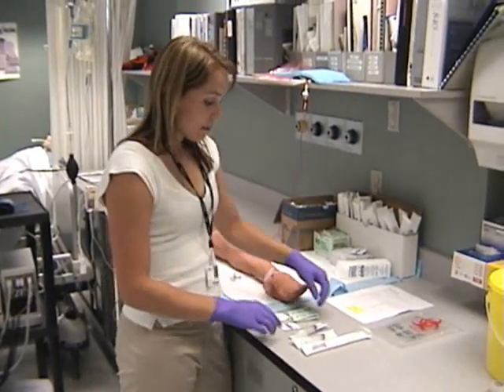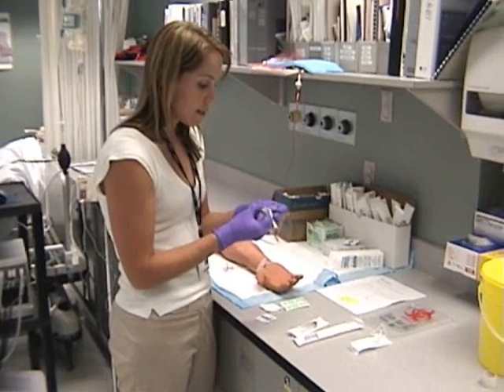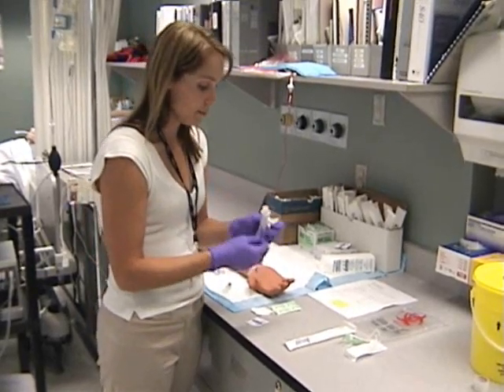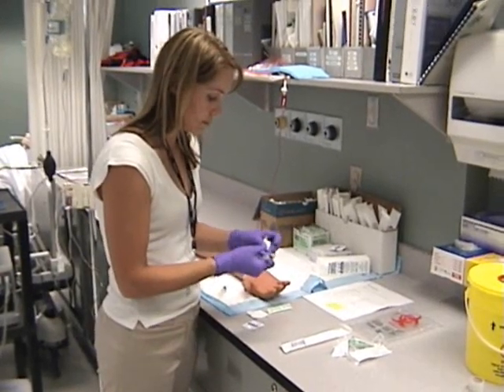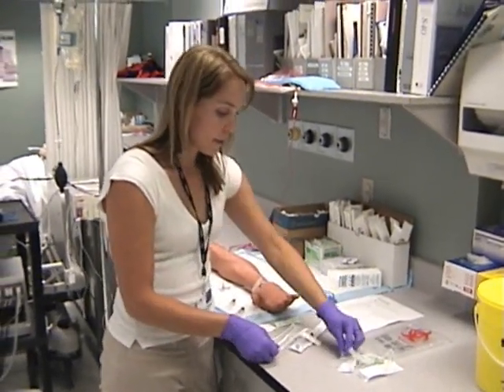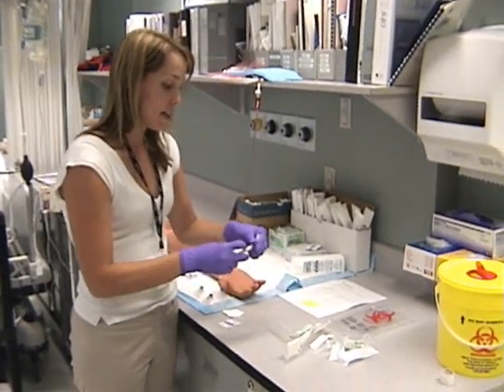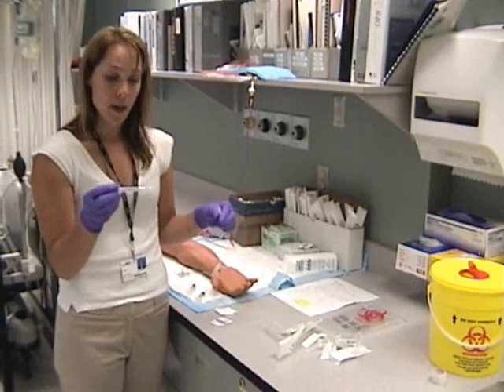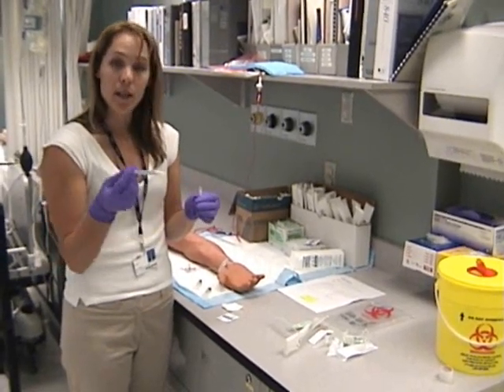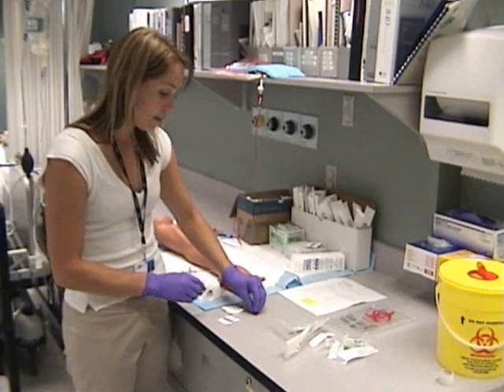To do the procedure, set up your equipment. For each of the syringes, open and put on the blunt plastic cannula — these are the needleless systems, and most hospitals are using this method to help prevent infections occurring in the line. This art line kit does contain a needle, so we won't be using that; set it aside and put it in the sharps container later. When using an arterial blood gas syringe on an art line, they will sometimes come vented and sometimes non-vented. If vented, pull it back to about one mil, which is the sample size. If non-vented, keep the plunger fully pushed in so you can withdraw later. Attach the blunt plastic cannula and keep your cap ready for later.